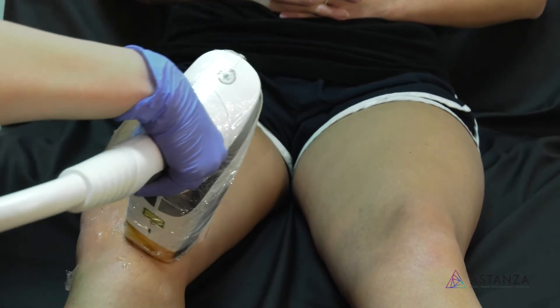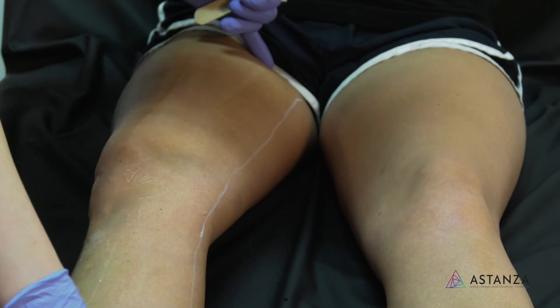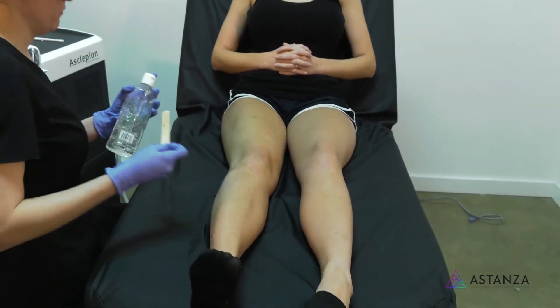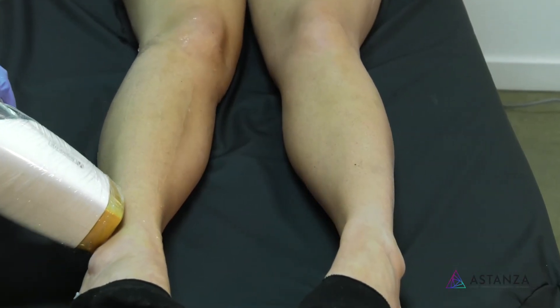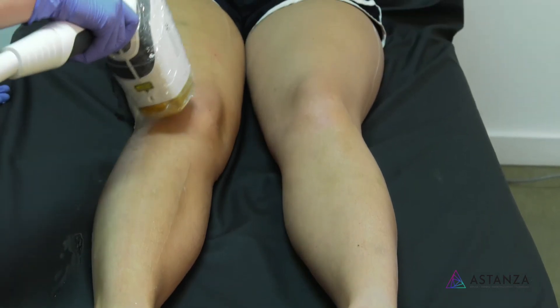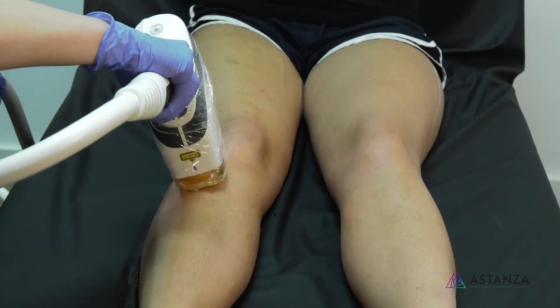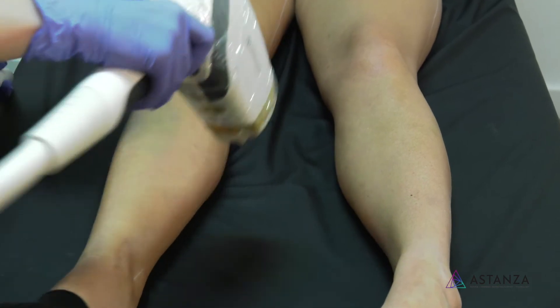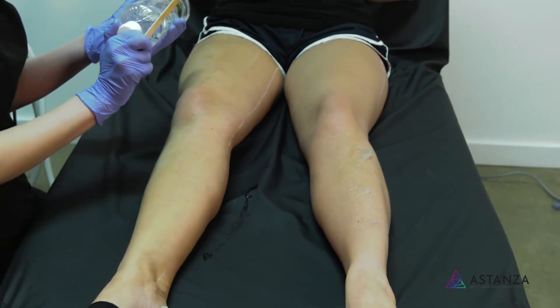During the leg treatment, Holly checks in: 'You doing okay?' Whitley confirms she's doing great. Holly marks her place for when they turn over so she knows where to start. Whitley reports that she doesn't feel anything — 'That's awesome!' Whitley confirms she would definitely do this again. They discuss how laser hair removal is a great investment over time, saving on shaving supplies and the hassle, especially compared to nicking yourself shaving. Whitley says she'll tell her friends it didn't hurt.